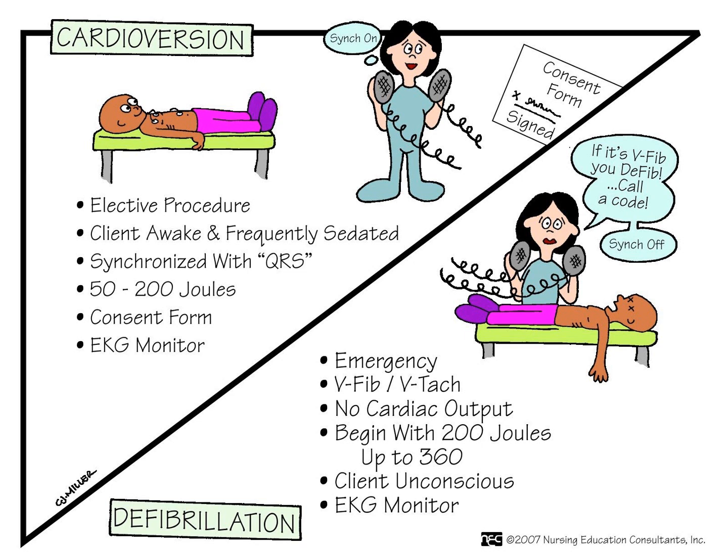Synchronized cardioversion is shock delivery that is timed with the QRS complex. Okay? This synchronization avoids shock delivery during the refractory portion of the cardiac cycle, when a shock could produce ventricular fibrillation. In other words, we want to avoid shocking this person during the refractory period of the cardiac cycle because it could put the patient into a VFib, okay, which is a lethal arrhythmia.